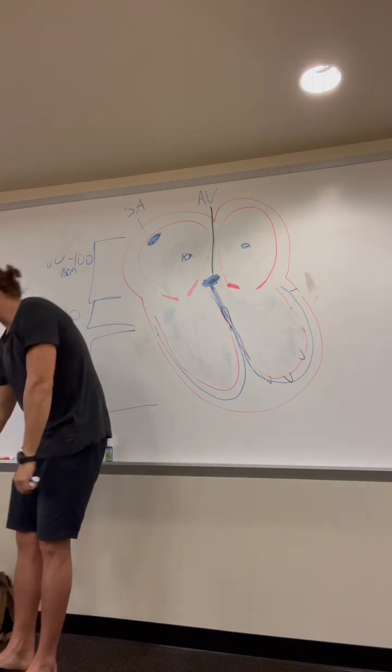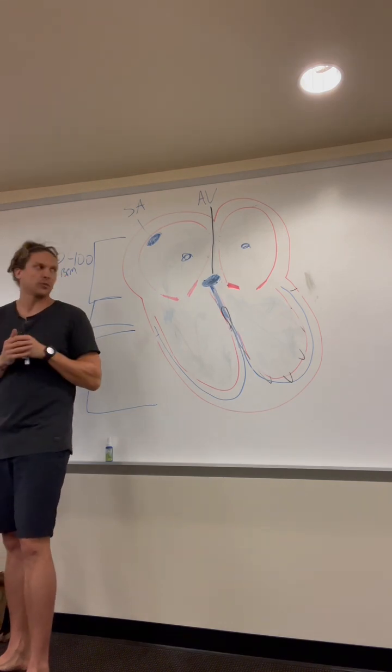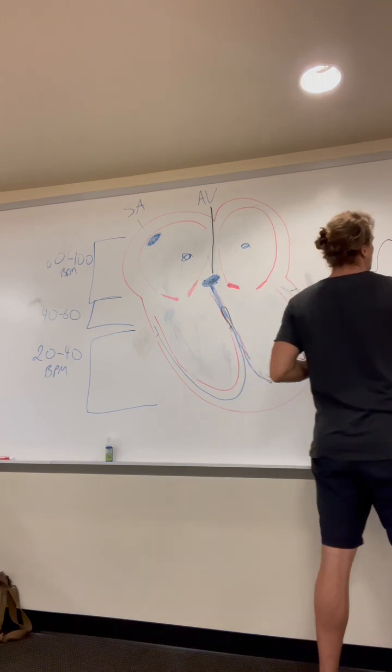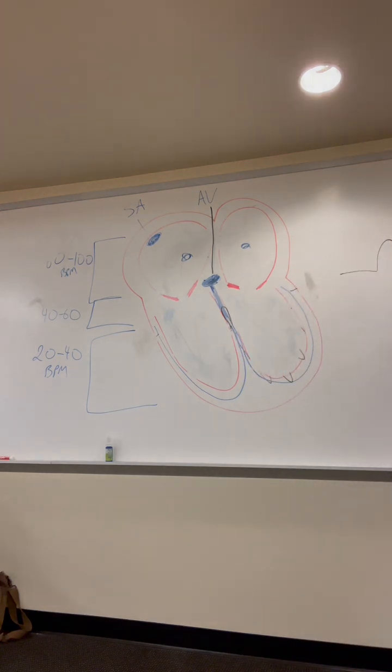And then intervals. The beginning of your P wave to the beginning of your QRS is your PR interval, and it's allowed to have 5 of those little boxes, or one big box. So on your EKGs, there are the little boxes.